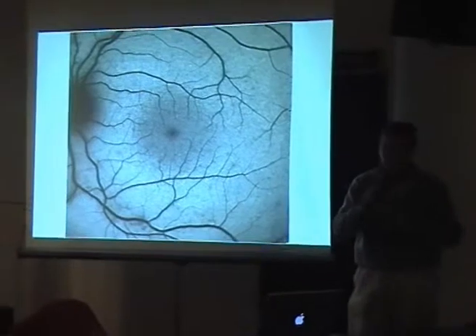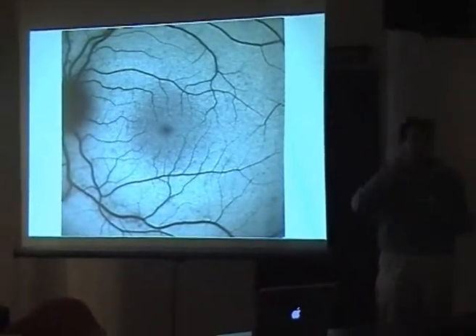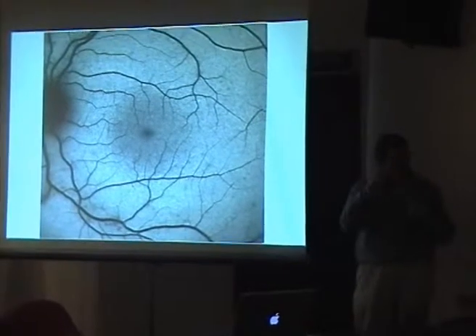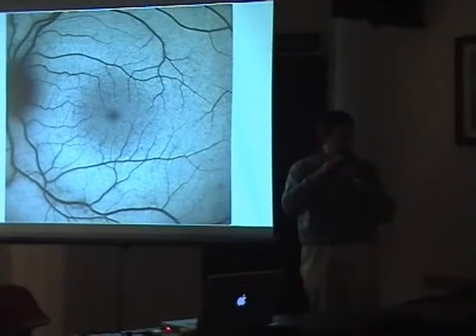And that is quite interesting because it can help to explain some pathology. And if we have time, it's a little bit more difficult, so I will go step by step, and I will show you some cases where it's important to know.